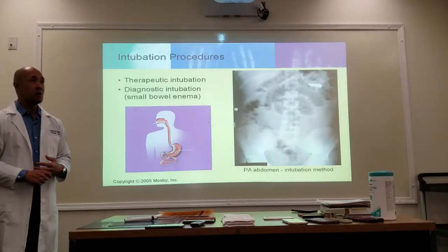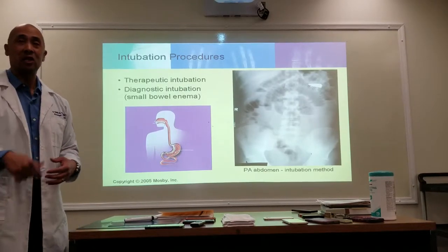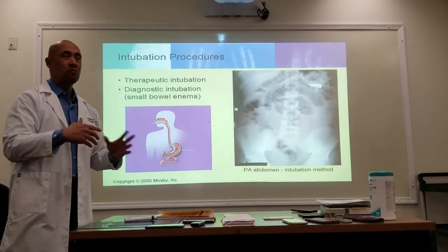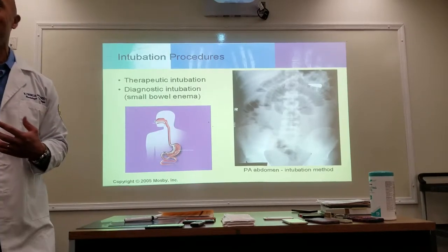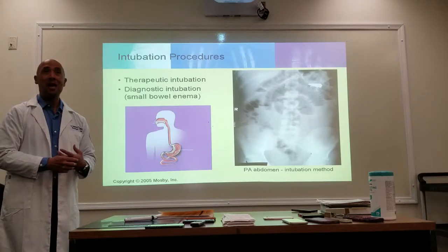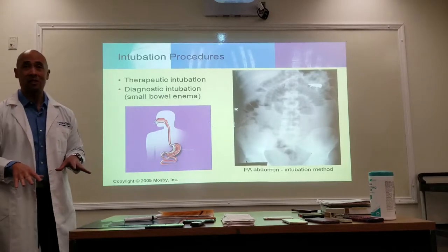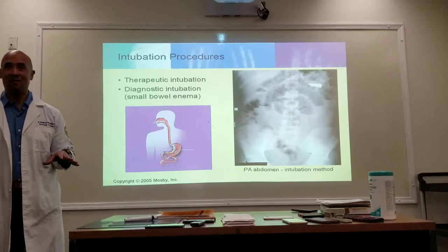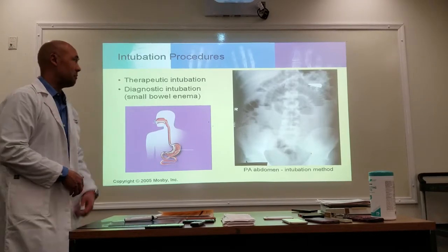There have been a few times when I did a small bowel series on an inpatient who couldn't come down. So we gave them the contrast up in their room, and the first couple of hours were hard because we shot portable KUBs. Have you guys done portables yet? We shot portable KUBs every 15 to 30 minutes for the first 2 hours. Then every hour we went upstairs to get that plate underneath him and do 1 hour KUBs. After 6 hours, the doctor said stop, we'll do one the next morning, because it wasn't moving anywhere. And then we shot a KUB the next morning and the contrast would still be in the same place.